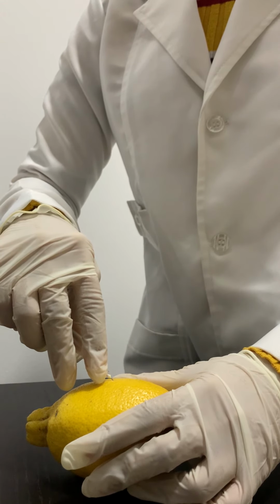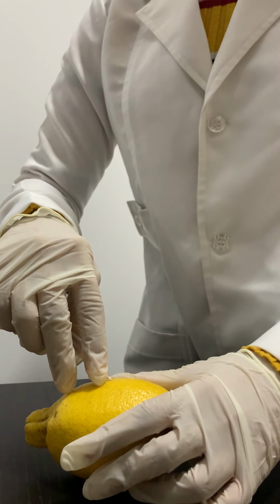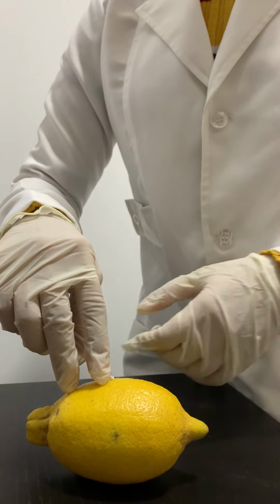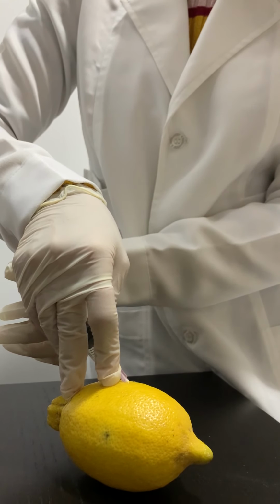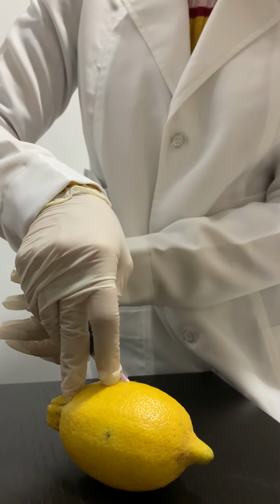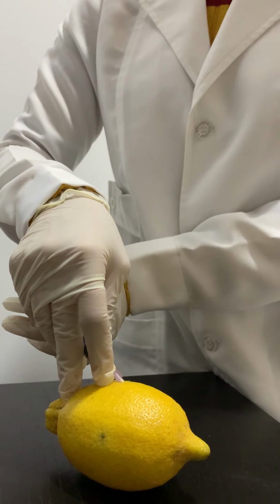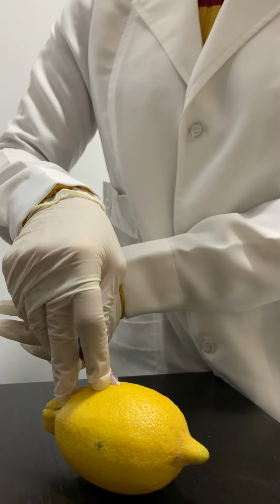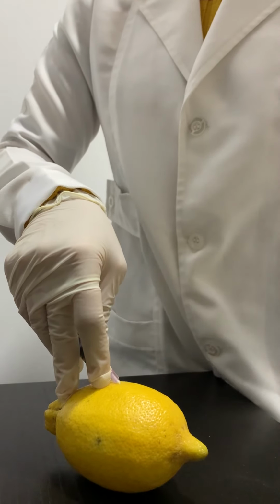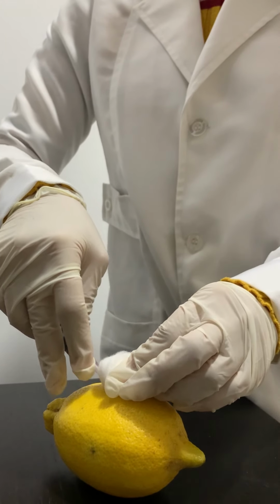Once it's inside, this hand will be fixing the syringe, and you can release the other hand and advance the solution. When the solution is inside, we can use a sterile cotton on top of the needle and then withdraw the needle.